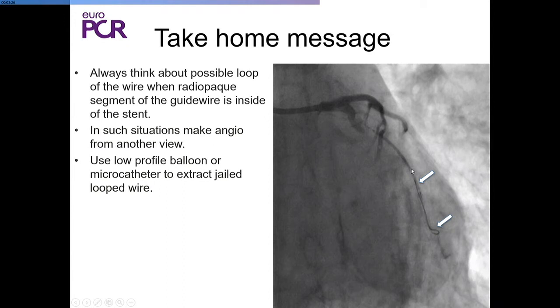All right, thank you very much. I think there was a lot to learn from that very interesting case. The learning points have been highlighted. One is the issue about the buddy wire and being careful with it. The second is that I think there were some clues up front that there might be trouble related to the loop. The third, I agree that even though contrast was an issue, perhaps earlier use of OCT may have been helpful in anticipating that there would be that much stent deformity, because she was lucky. Nine days later, there could have been a lot that had gone wrong in that time. So I think that might have been something to help the patient a little bit better. But thanks.